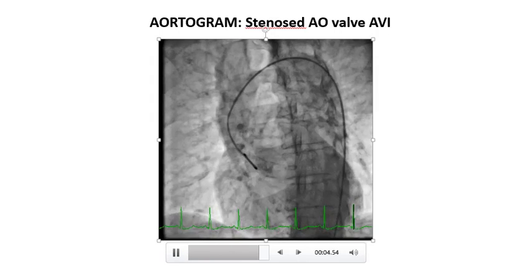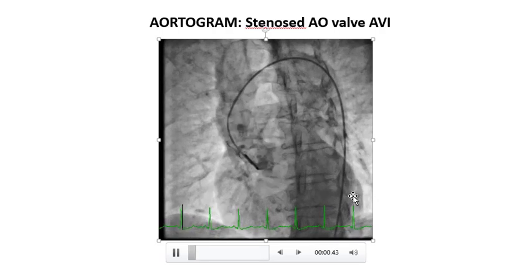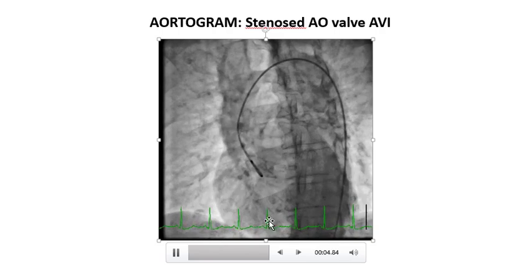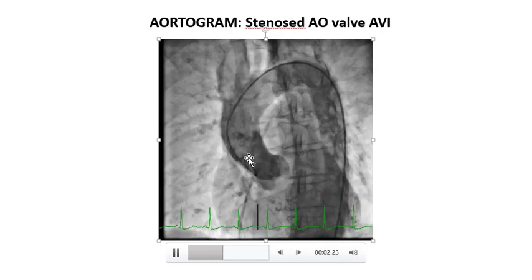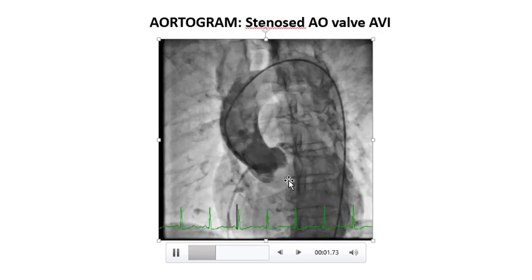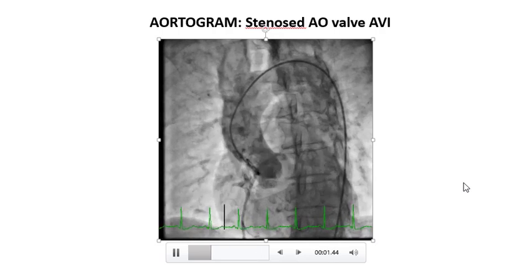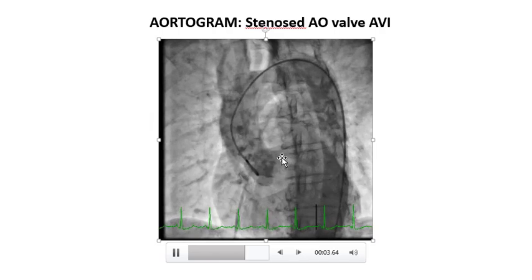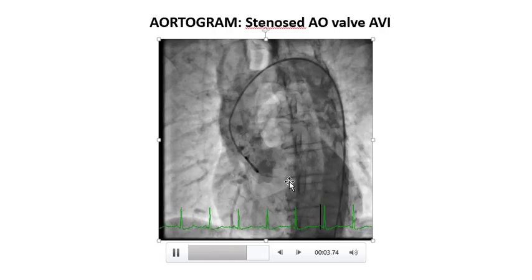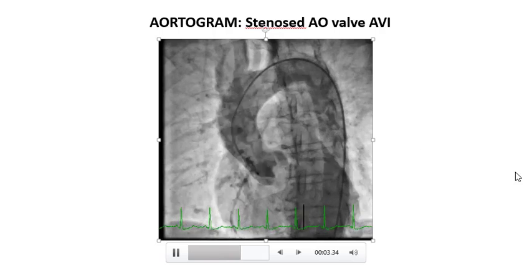This is a shot very much like that second shot I showed you at the very beginning, and this time there is no leakage back into the ventricle, so you can't see that circular portion filling with dye. The dye is going in the same direction. The aortic valve stops that flow. But if you look very closely, you can see the opening of the valve and only one leaflet is moving. You know there are 3 leaflets to the aortic valve. You can see the 3 aortic cusps containing the sinuses, and the blood coming from the ventricle only has a narrow opening to course through.